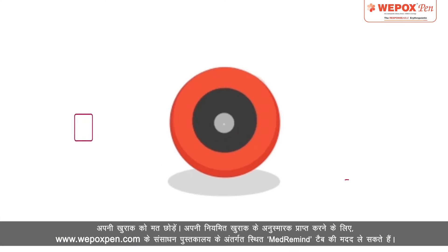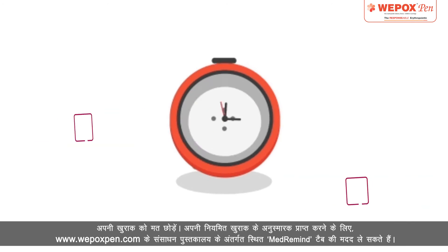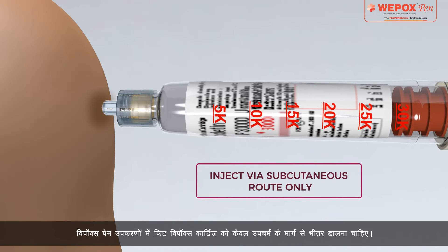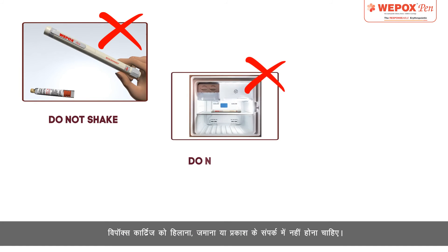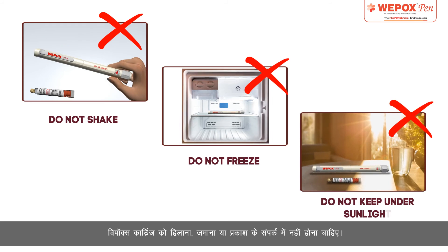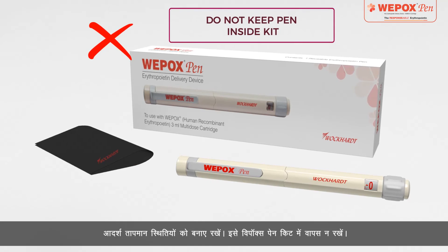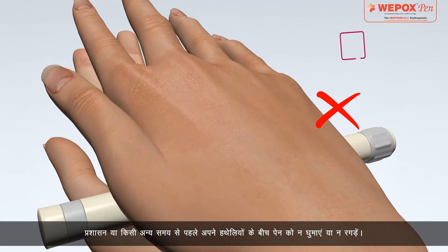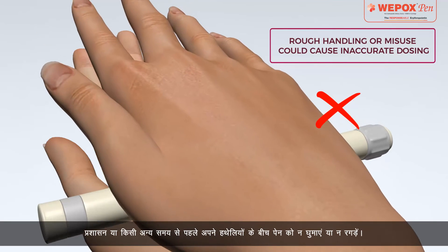To get reminders of your routine doses, you can seek help from the MedRemind tab located under Resource Library. Wipox cartridge fitted in Wipox pen devices must be injected by subcutaneous route only. Wipox cartridges should not be shaken, frozen, or exposed to light. Maintain ideal temperature conditions. Do not keep it back into the Wipox pen kit. Do not roll or rub the pen between your palms before administration or at any other time.